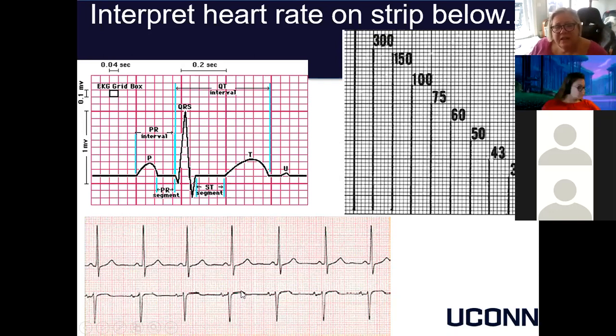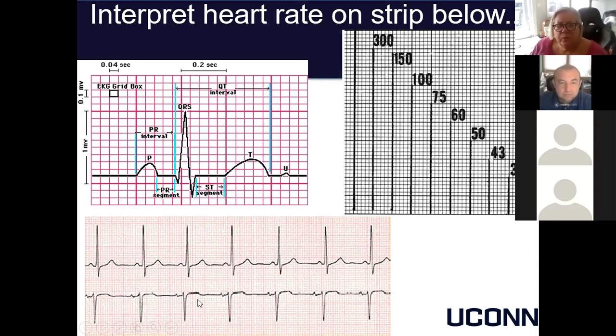Interestingly enough, in this one, look at that ST segment. This is what you would call the baseline. Is that ST segment elevated above the baseline? Yes, 1 millimeter. So if this was marked, you would know which lead this was in. That's AVR, most probably. AVR? Yep. And if the upper one is the second one, probably. Right. And that usually gets marked even on a telemetry.